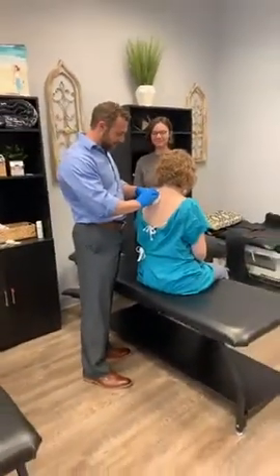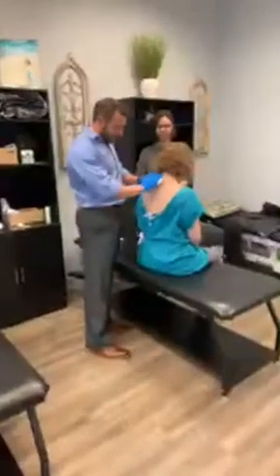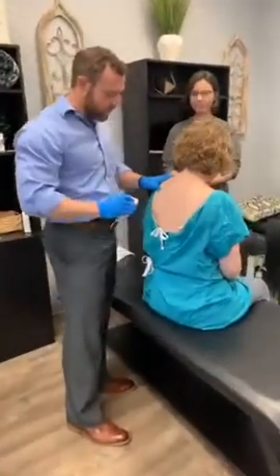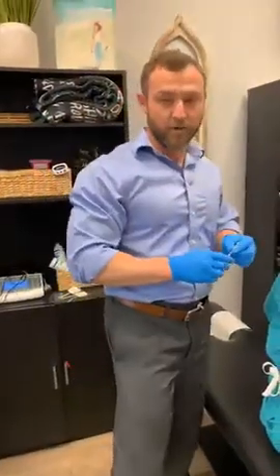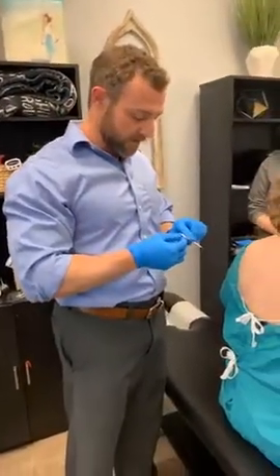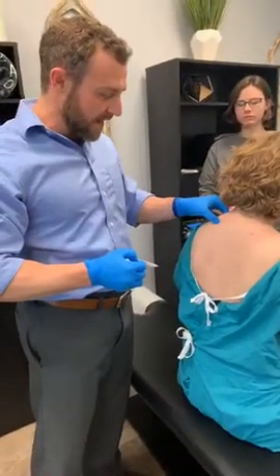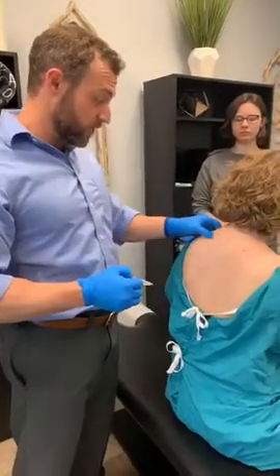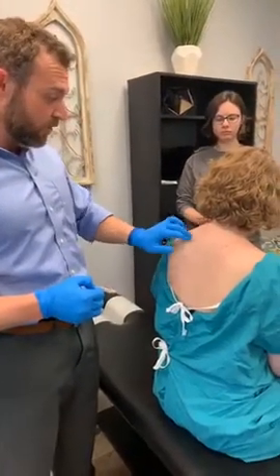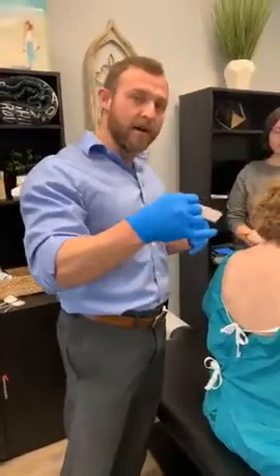All right. So what we're doing is a little dry needling, and it's something new we've just started doing here recently. What we're finding is that it really helps with a lot of chronic trigger points that are giving patients a lot of pain, muscle spasms, and tight areas within the muscle that get referred pain. These trigger points will develop in overworked areas of the back and neck, and then they can refer pain to other areas of the body.